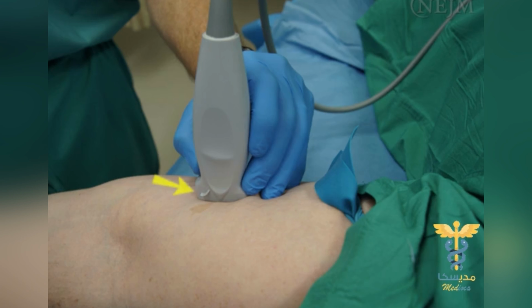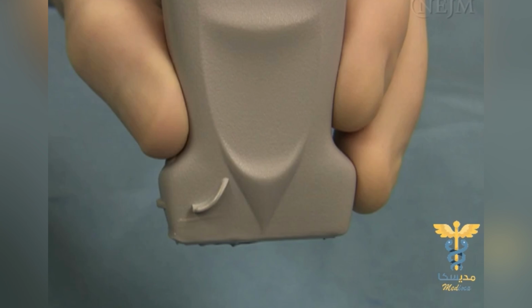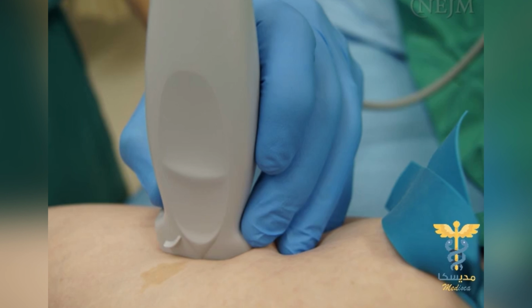The transducer indicator can be aimed proximally or distally, depending on personal preference. However, it is crucial to know which side of the image represents the distal vein because that is where the needle will enter the image. Hold the transducer with your thumb, index finger, and middle finger. Place your other fingers on the patient's skin so you can hold the transducer completely motionless during the procedure.